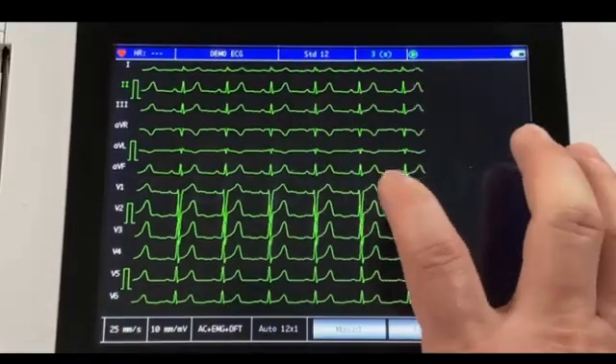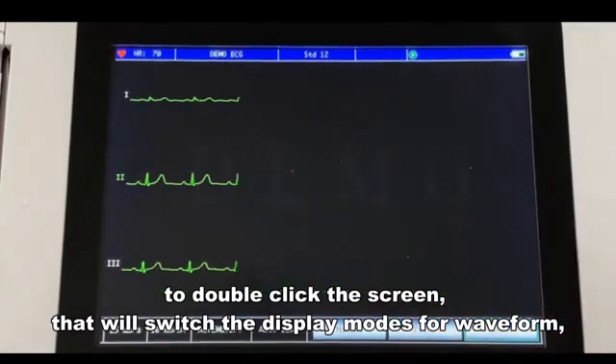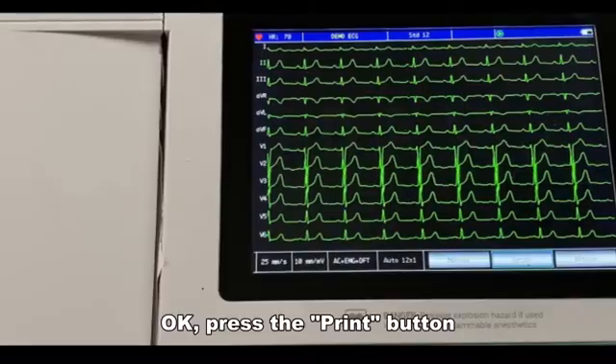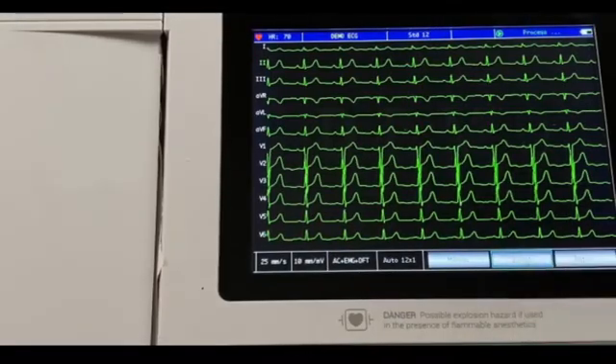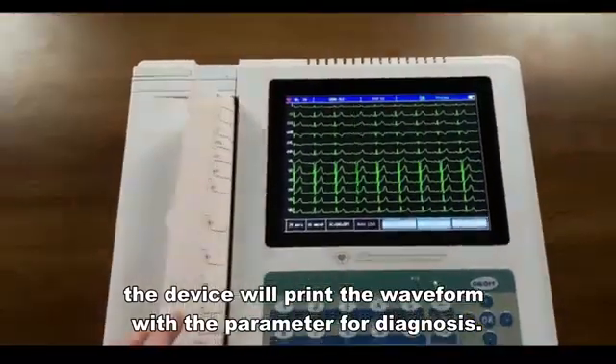By the way, double-clicking the screen will switch the display modes for the waveform. OK, press the print button. The device will print the waveform with the parameters for diagnosis.